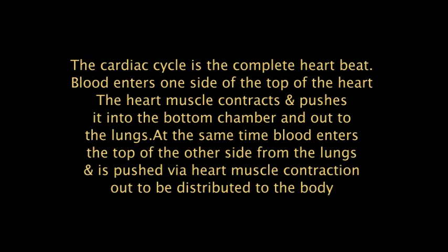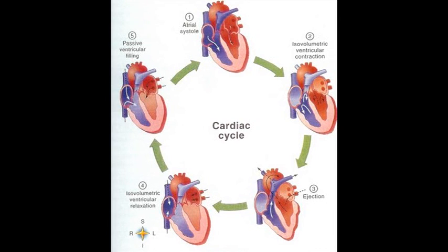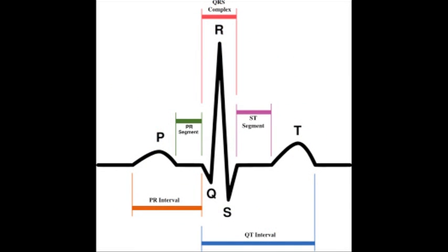The electrical activity that occurs during a cardiac cycle can be recorded on an electrocardiogram, or ECG. When the heart muscle contracts, there is a change in the electrical potential across the membrane of the muscle fibres. As body fluids and tissues are good conductors of electricity, the electrical changes that occur in the contracting myocardium of the heart can be detected by attaching conductors to a person's arms, legs and chest. All of this is measured via the ECG. A normal ECG shows 5 waves that are named P, Q, R, S and T.